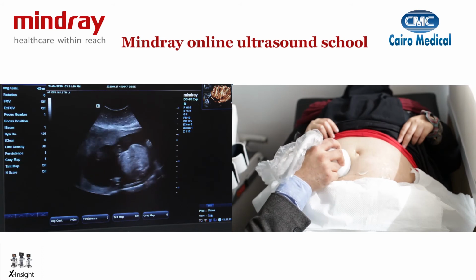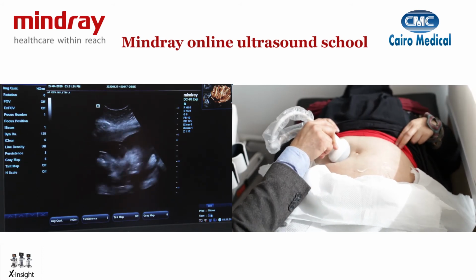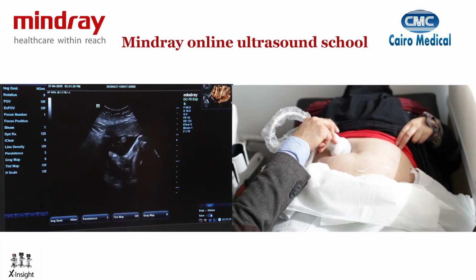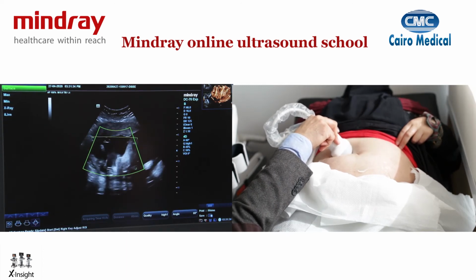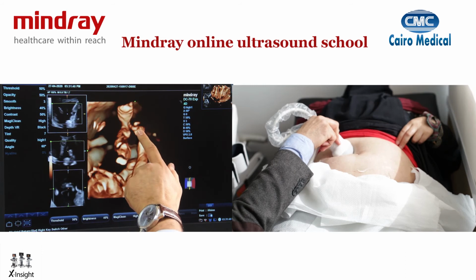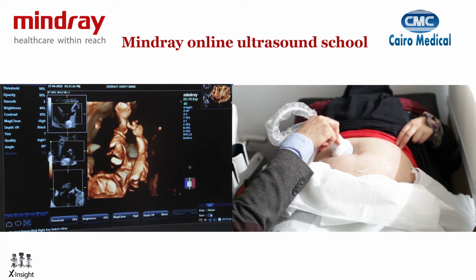So I'll come parallel to my target, so that's my leg and foot here. You can see the angle of the foot. If I put my 3D and 4D parallel to it, then I'll get a view of the angle of the ankle. I'm going to update it now. Can you see the angle of the ankle? And you can see the toes here. Okay.